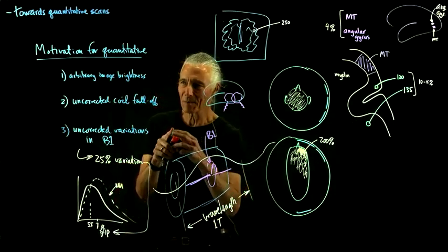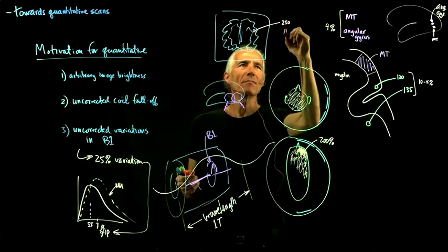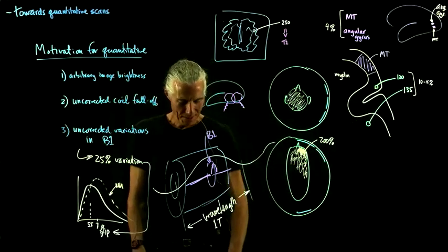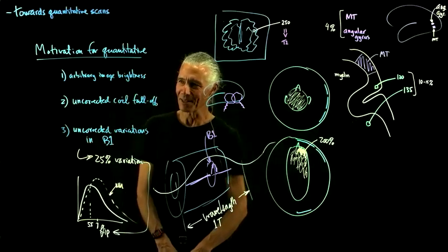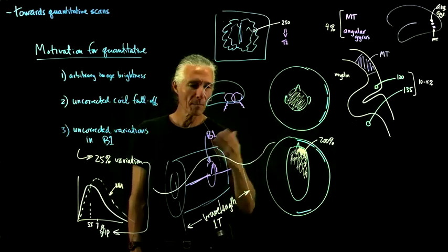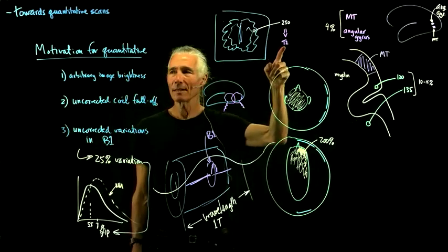What if instead we had something that was actually T1, in other words, if the number coming out of here was actually T1? Then we could do a scan on somebody and then do a scan next year, and say, well, Bill, your T1 has gone to hell. You really have to start improving your diet or stop drinking, because you could actually see this difference in an actual number from year to year. Or you could compare a different scanner. What if the scanner manufacturer makes images that have numbers like 25,000? Well, that's just an irrelevant number. You could actually get a real T1 number out of there.